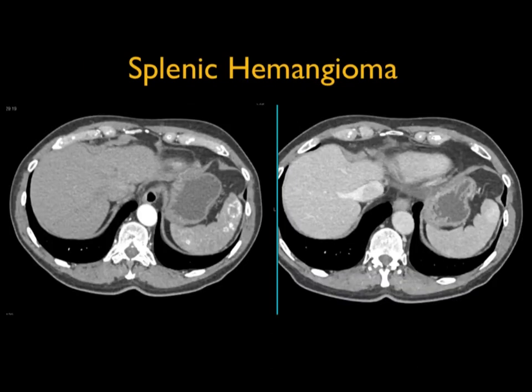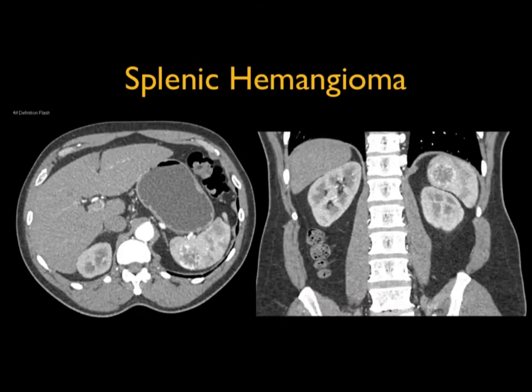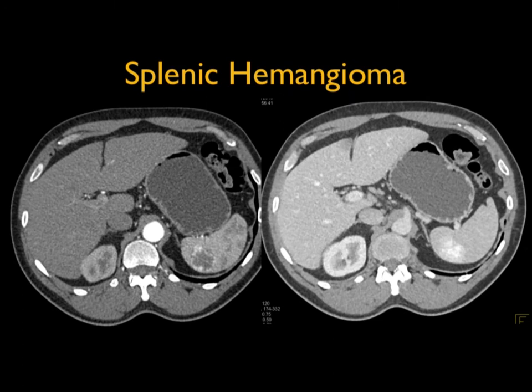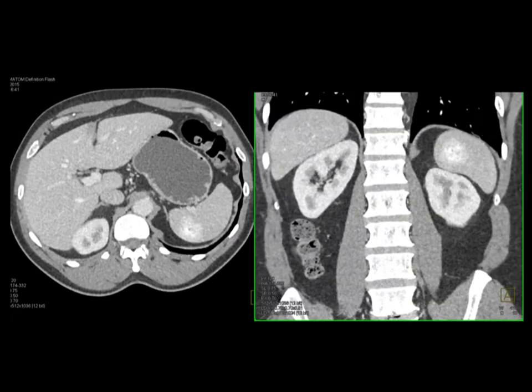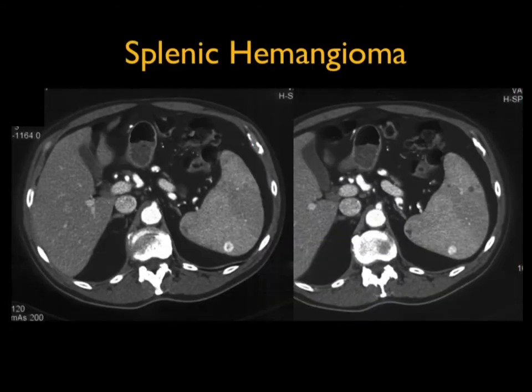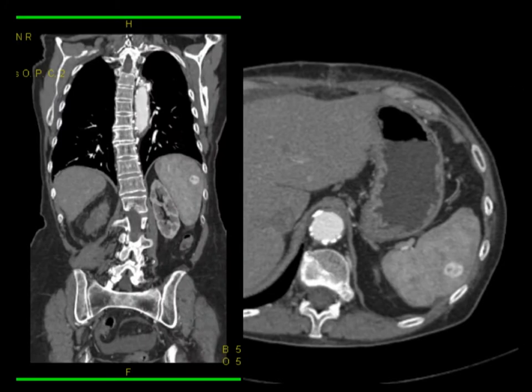Here are a couple of examples. Here's a very nice set of hemangiomas with peripheral enhancement, and you can see they're essentially gone by the venous phase. Another example shows a dominant hemangioma which over time fills in very nicely. Or in this example, again prominent enhancement in the splenic lesion which filled in over time. When you think about splenic hemangiomas, this round circular lesion is a very good appearance — that donut appearance we also talk about in hepatic hemangiomas.